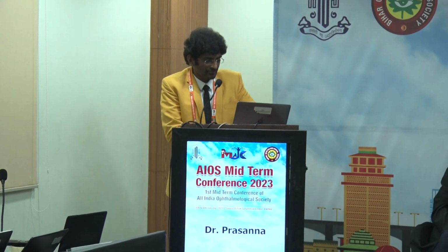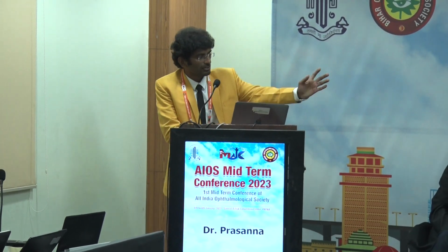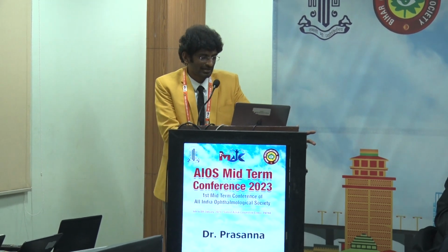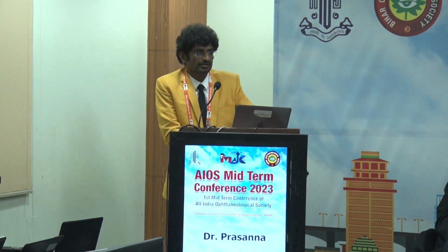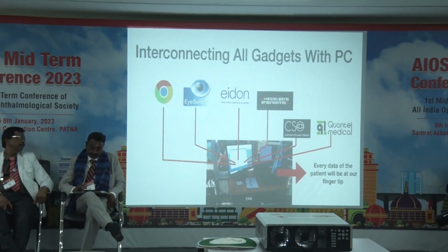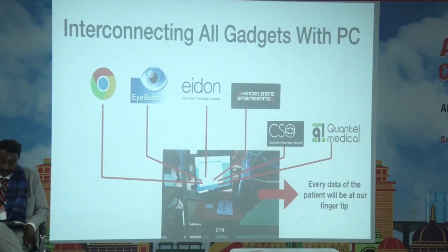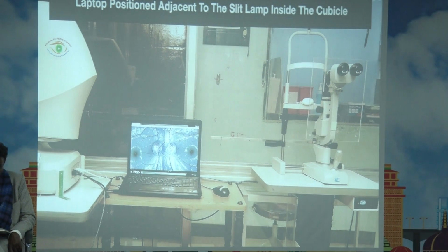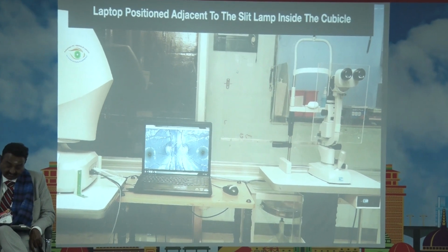So I call it the Marvel infinity stones, where every stone is interconnected and the gauntlet yields tremendous power to the one who wears it. What we did was we interconnected all the machines to the local area network, and every data was interconnected to a computer, so that wherever we are, it will be at our fingertip through the computer, which was positioned very close, adjacent to the slit lamp inside the cubicle.